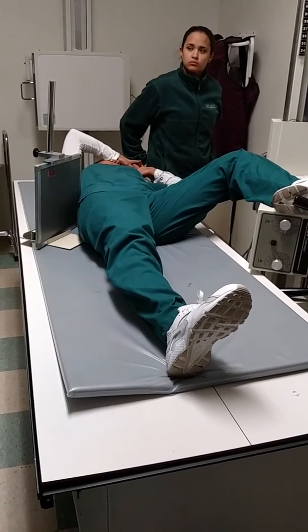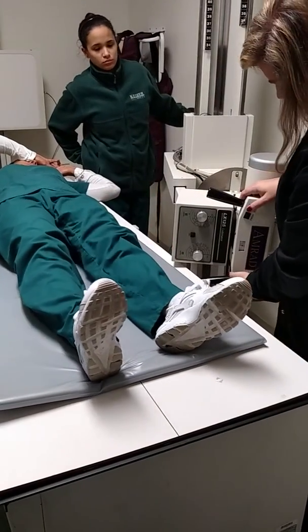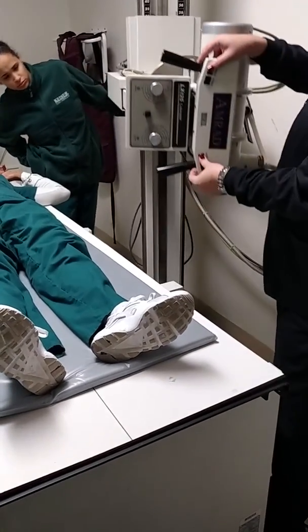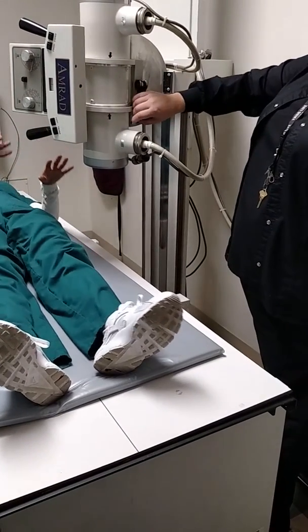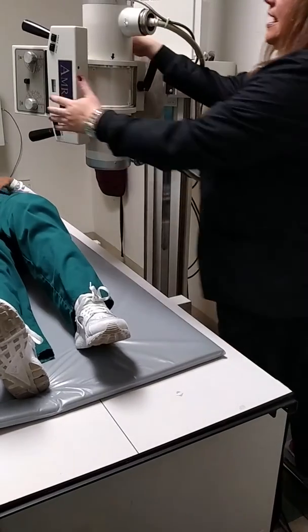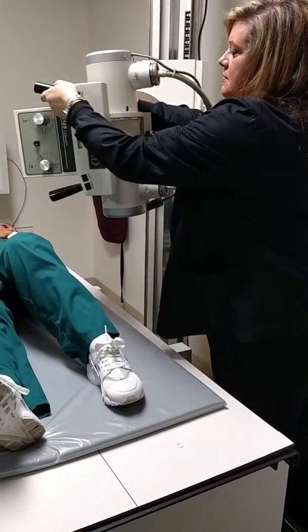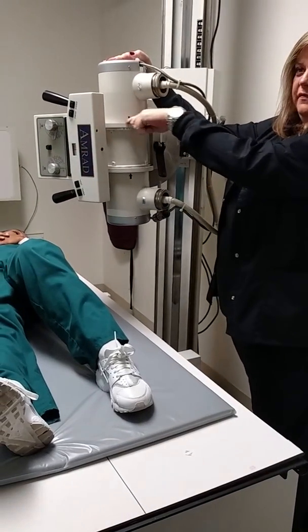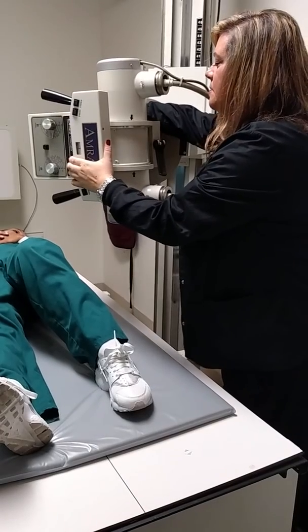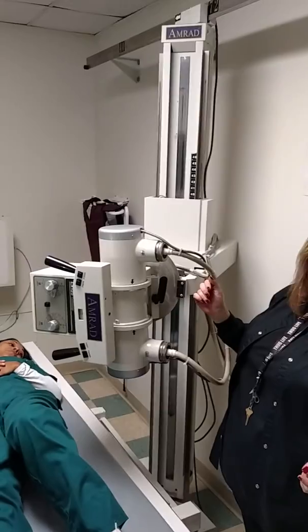So what did you do with that? Okay, so over here, okay, so we got this. Good. Let me just move this so I can show you the equipment stuff. We have not learned this thing right here. What this does is if I lock this, I can't move this way. But if I unlock it, see that swivel that I'm doing there? There's numbers right here. And if I have it on 0 and lock it, this is what we're all used to working on, with that at 0 and locked.